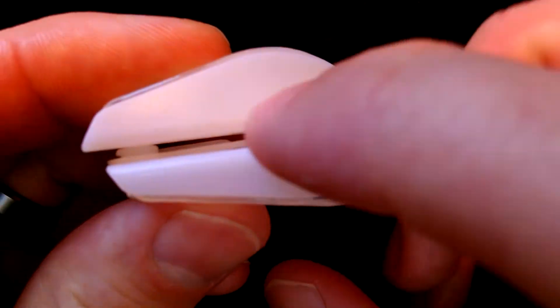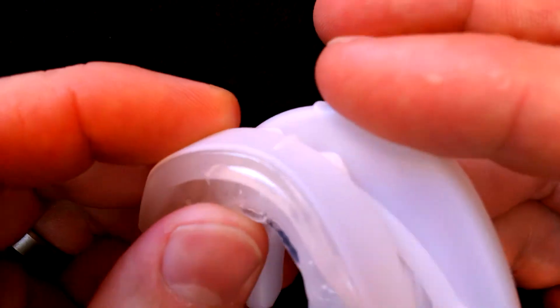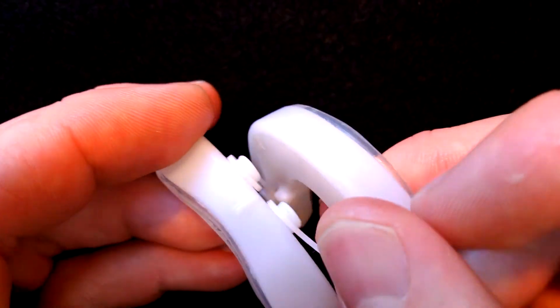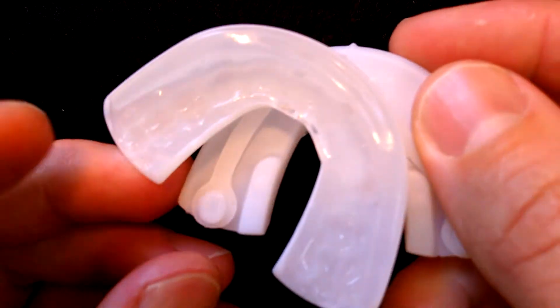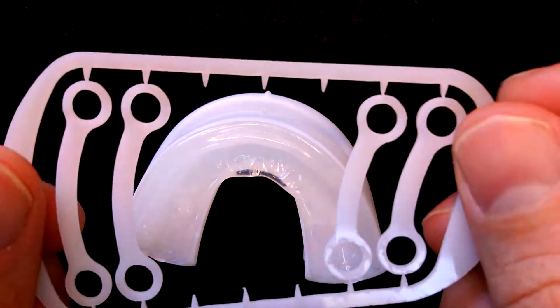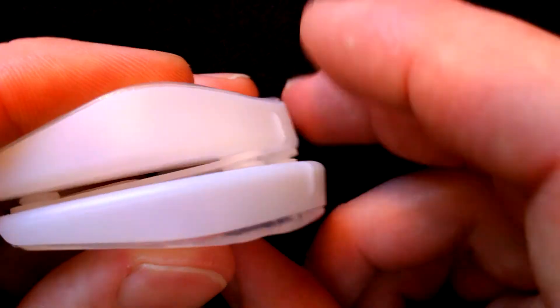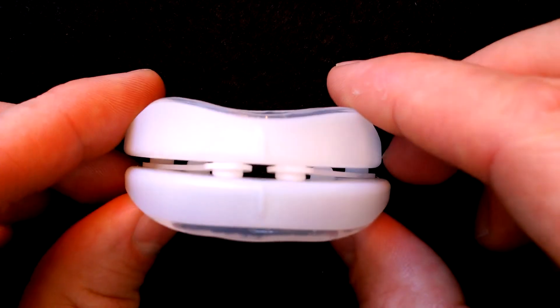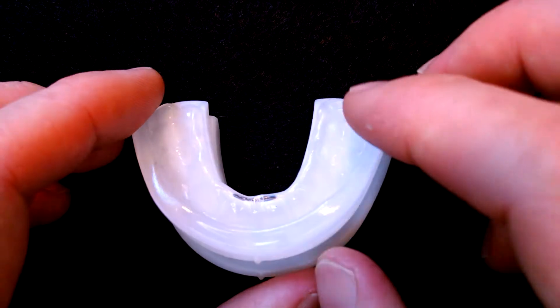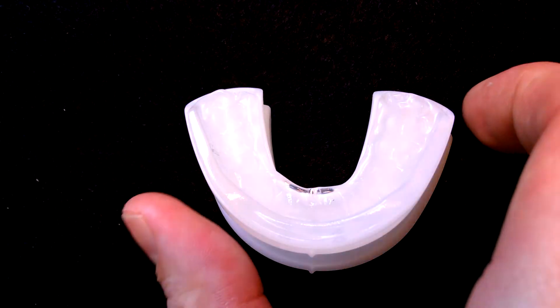The Sleep Pro Contour also has a hard plastic frame with a soft thermoplastic lining. This particular one is actually adjustable. It has these bands at the front and they run all the way from the rear to the front and back again. You can actually swap these out — there are shorter ones and longer ones, so obviously the longer ones are going to give you more advancement. This one has a long slot at the front that's going to allow you to breathe freely through your mouth while you're sleeping. The Sleep Pro Contour is about $131 plus $10 shipping, so about $141.